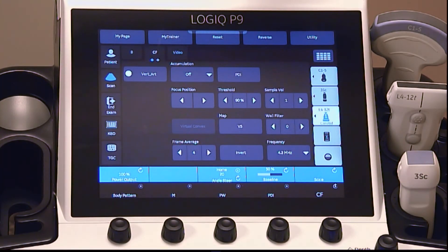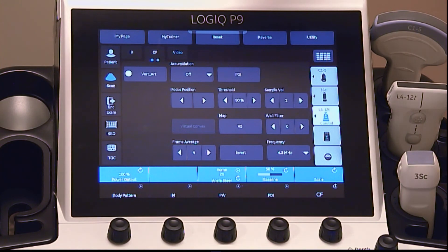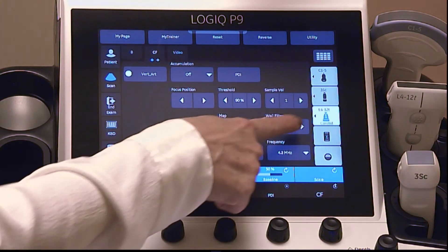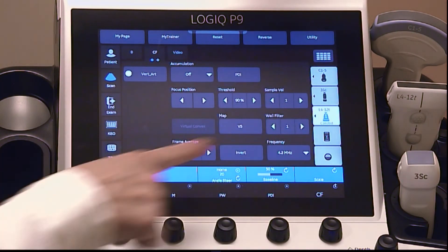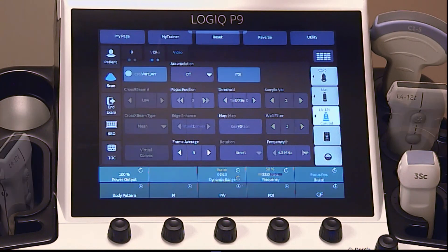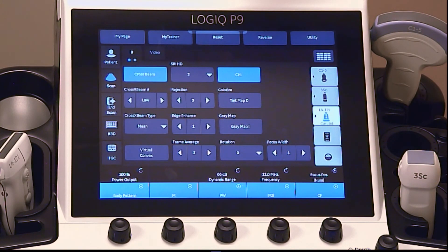The wall filter removes low velocity signals and affects low flow sensitivity. This helps eliminate motion artifacts caused from breathing or other patient motion. Please refer to the Logic P9 Quick Card Guide or User Manual for additional parameter details.